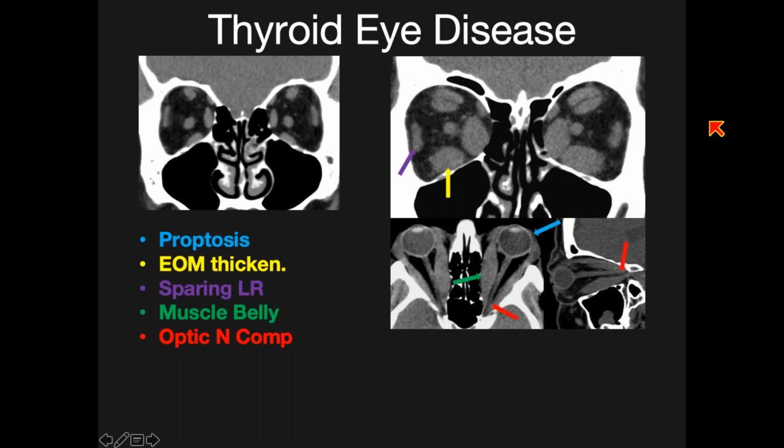Proptosis is another big group that we image quite regularly, and one of the common indications to image patients is thyroid eye disease. Proptosis itself is a clinical diagnosis, and what imaging is helping with is diagnosing what's the cause for that proptosis. Could be unilateral, could be bilateral.